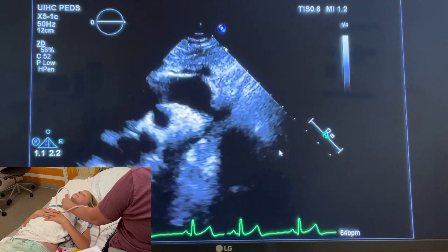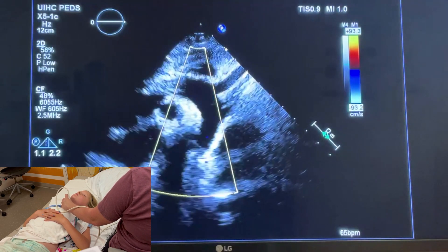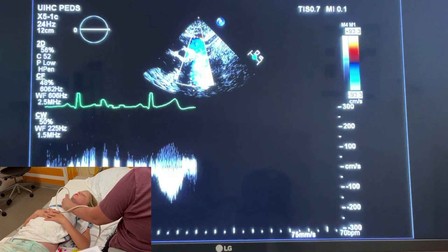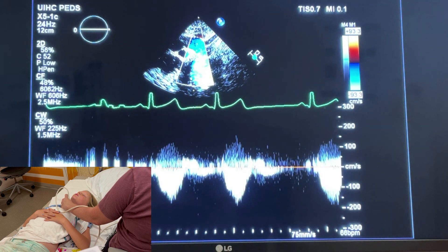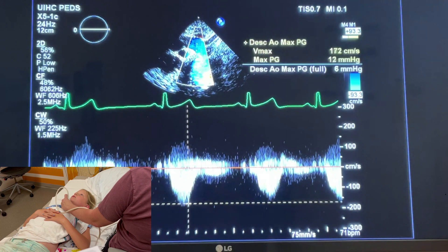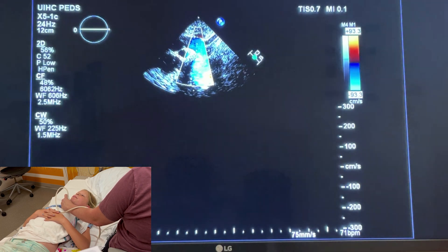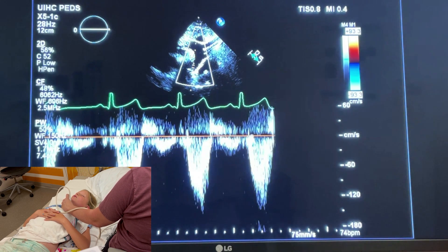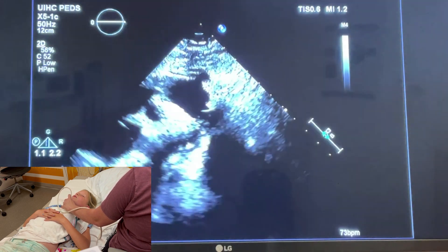A PDA will be in this region as well; you will see it by color flow. Take a color picture, then put in continuous wave looking for any increased flow in the descending aorta. You can measure the descending aorta maximum pressure gradient there. We'll also use pulse wave Doppler.